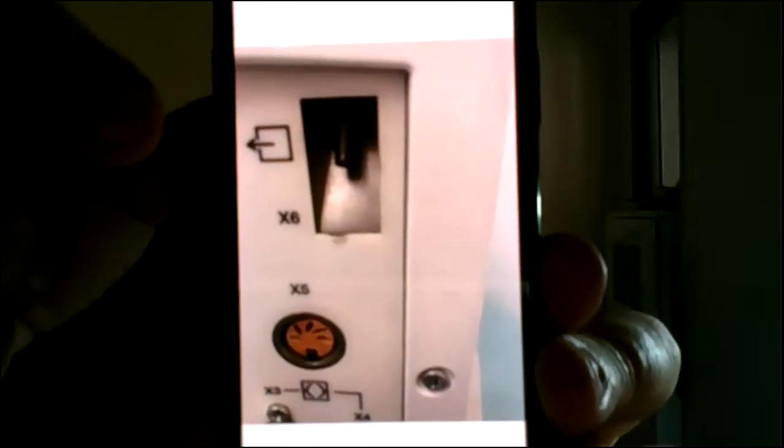Okay, you see here? Yeah, we can actually see a little bit. Okay, this is the exhaust of one of our gas analyzers, at the back. Is that the back of the machine? Yes, and here is a regular extension line that I'm connecting here. A little close up. Okay. Another model with the exhaust in the front of the machine. And here you see I'm connecting it.